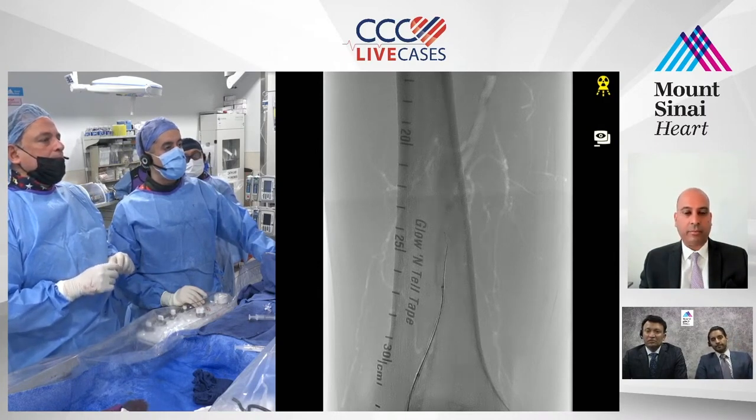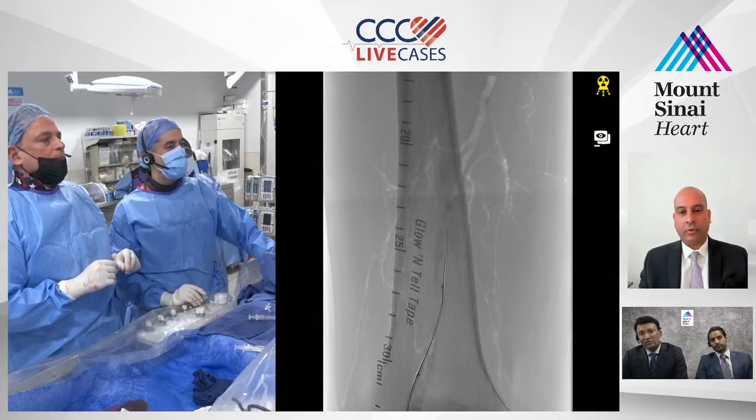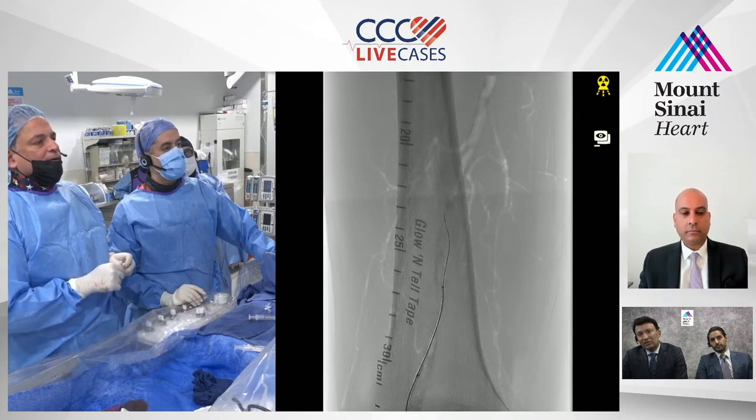Versus just straight angioplasty. I mean, at the end of the day, this is going to have to be a stent, I think, right? Yeah, definitely. The question is, can we expand the stent through that segment? It's got to be a Supera, right? Supera, if you're going to go stent.